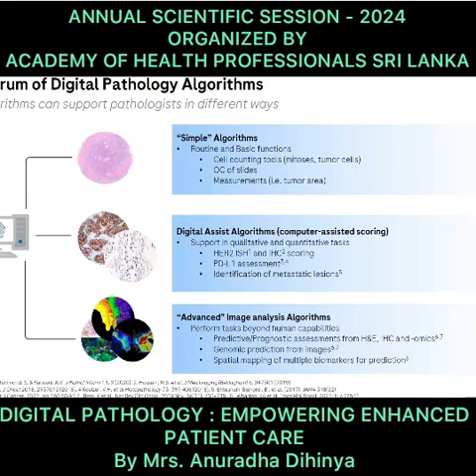We also have a PDL1 for SP263, which is for non-small cell lung carcinoma. Apart from that, many AI tools are now coming for HNE slides also. These AI tools can talk about the grading, and in the lymph node they will say whether the lymph node is positive or not positive, so for metastatic cases it does help.